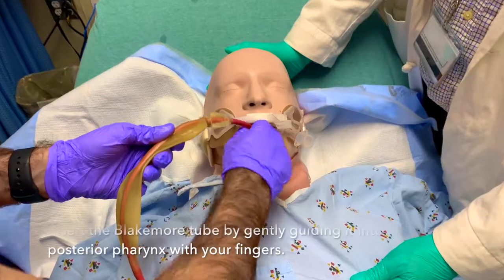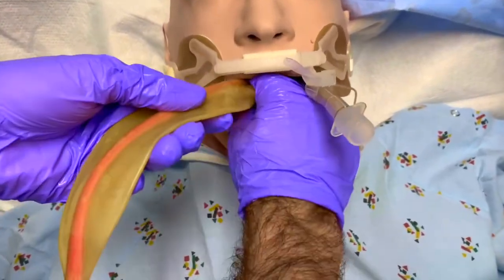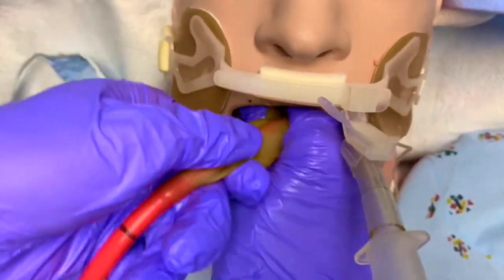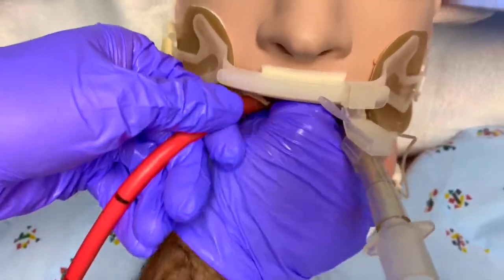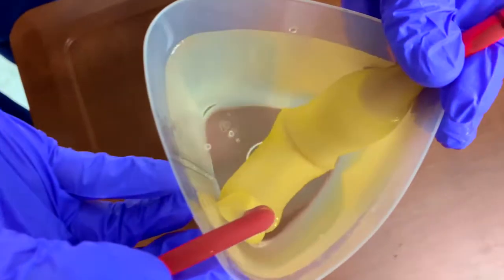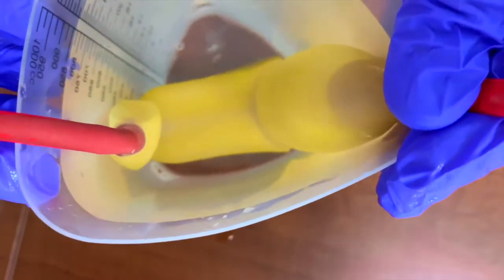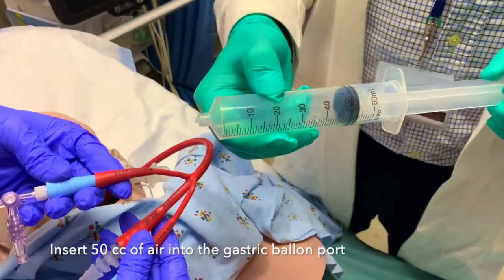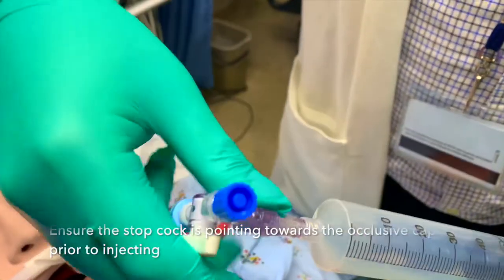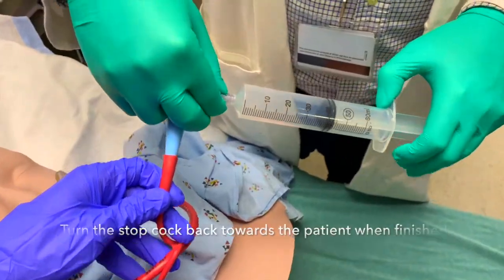Next, insert the Blakemore tube by gently guiding it into the posterior pharynx with your fingers. Advance until you reach a minimum of 50cm along the marking of the tube. If you have trouble inserting the tube, you can try soaking it in ice water to stiffen it. Next, insert 50cc of air into the gastric balloon port. Ensure the stopcock is pointing towards the occlusive cap prior to injecting, then turn the stopcock back towards the patient when you have finished injecting.